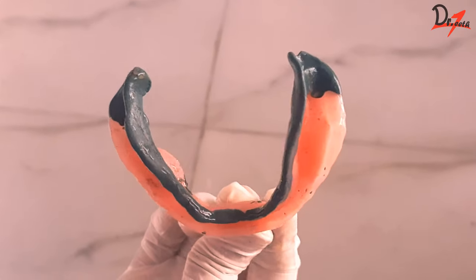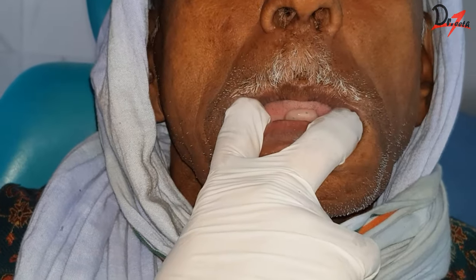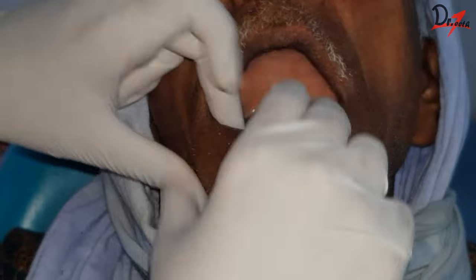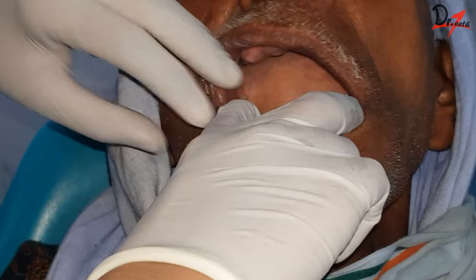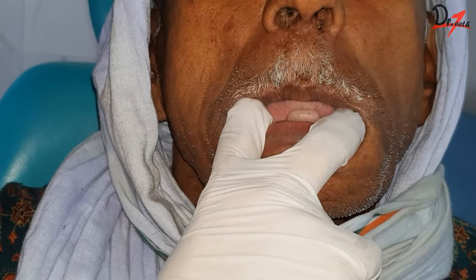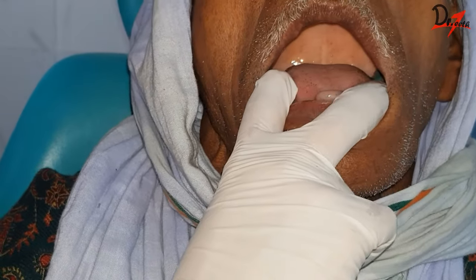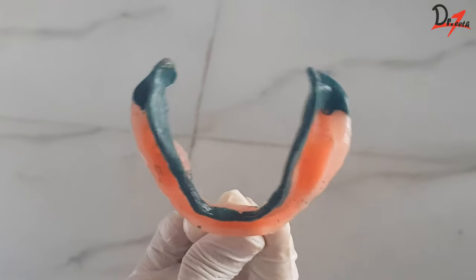Next comes developing the retromolar area and the buccal flanges. For this, we will ask the patient to open wide and close. For recording the buccal flange, the cheek is pulled buccally and then moved upwards and inwards. To record the masseter notch, the patient is asked to close while we exert a downward pressure on the tray — put downward pressure on the tray while the patient tries to close his mouth.